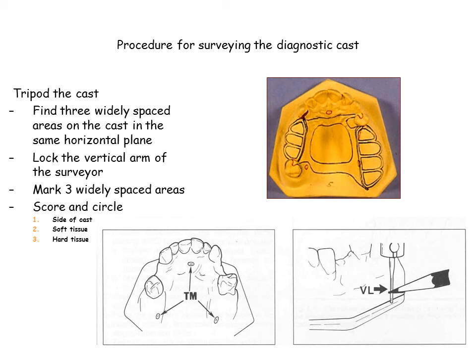Some method of recording the relation of the cast to the vertical arm of the surveyor must be used, so that it may be returned to the surveyor for future reference. One method is to place three widely divergent dots on the tissue surface of the cast with the tip of the carbon marker, having the vertical arm of the surveyor in a locked position. Preferably these dots should not be placed on areas of the cast involved in the framework design, and then the dots should be encircled with a colored pencil for easy identification. A second method is to score or mark two sides in the dorsal aspect of the base of the cast with a sharp instrument held against the surveyor blade. By tilting the cast until all three lines are again parallel to the surveyor blade, the original cast position can be re-established. The scratch lines will be reproduced in any duplication, thereby permitting any duplicate cast to be related to the surveyor in a similar manner.